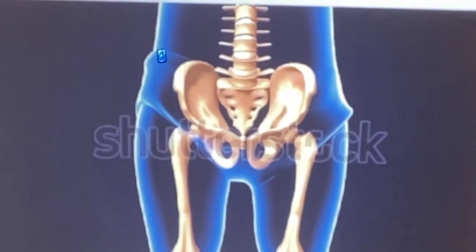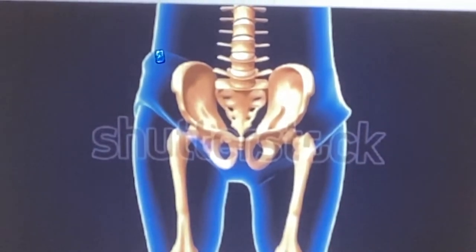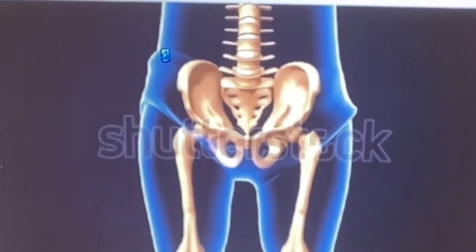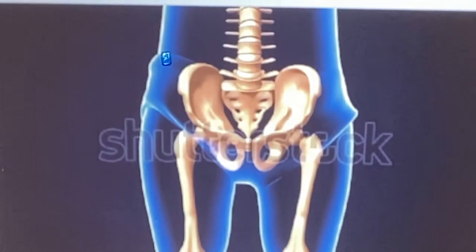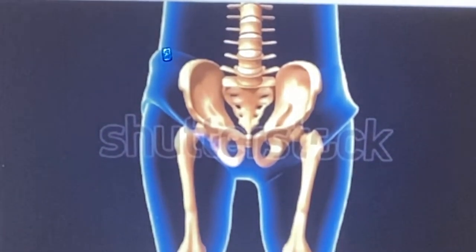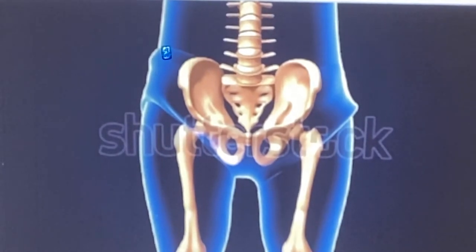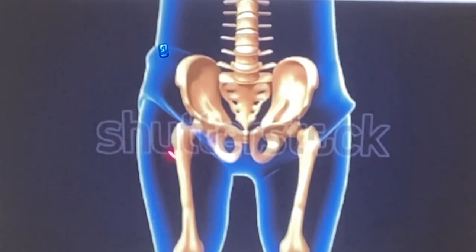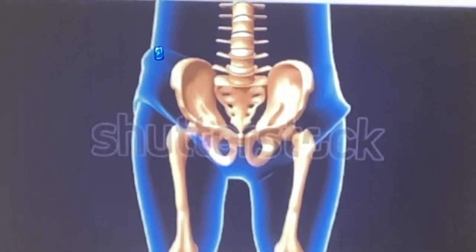Technical factors. kVp is going to be 85, and the mAs on a CR it's 20, on a DR it is 10. The structures shown, you want the head, the neck, the trochanters, and the proximal 1/3 of the body of the femur. You want the hip joint and the greater trochanter. Can't really see here, but you want that in profile.